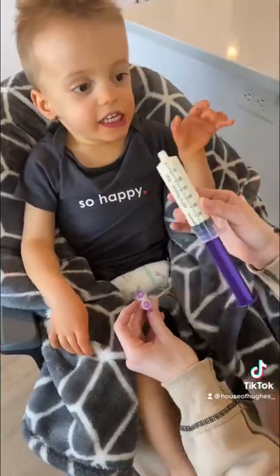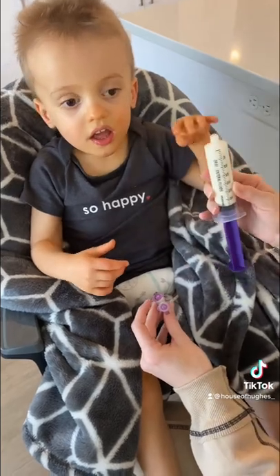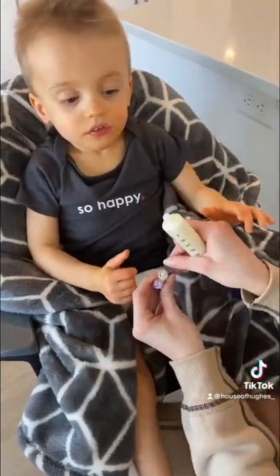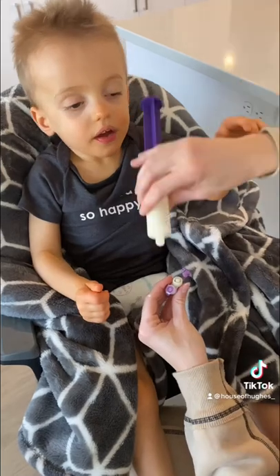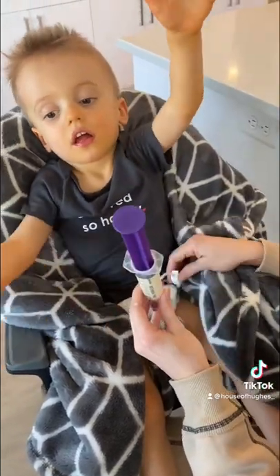We start off by putting the formula and water into a syringe. Good job bubba, you want to help mama? Then we're going to open up one of the ports and go ahead and just screw it on.